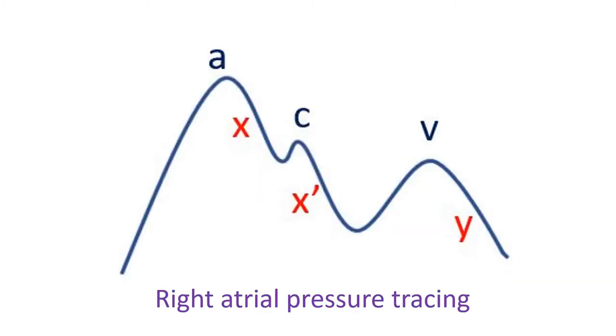Basic principle of cardiac catheterization is that in whichever chamber the catheter is introduced, pressure and oxygen saturation is measured. Continuous monitoring of the pressure at the tip of the catheter is done to obtain the pattern of the pressure tracings. The pattern of the tracing varies between the various heart chambers and also depending on disease conditions. It is usually higher in the ventricles when the heart contracts and lower when the heart relaxes.